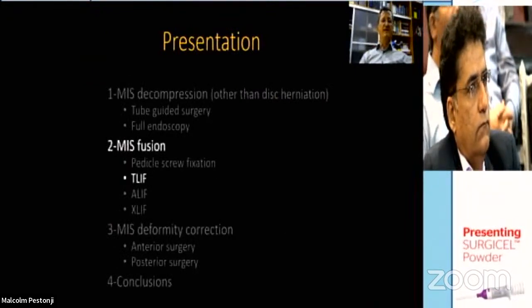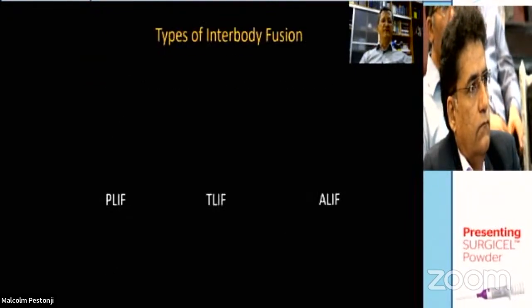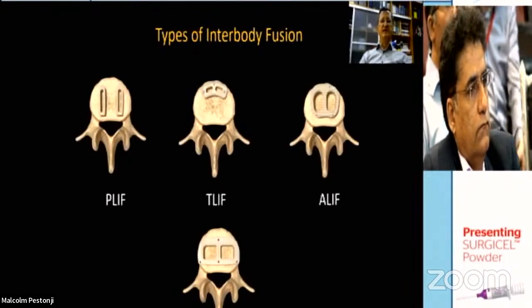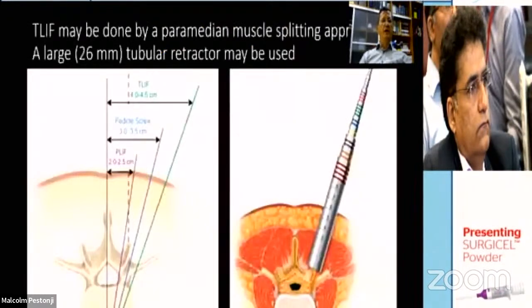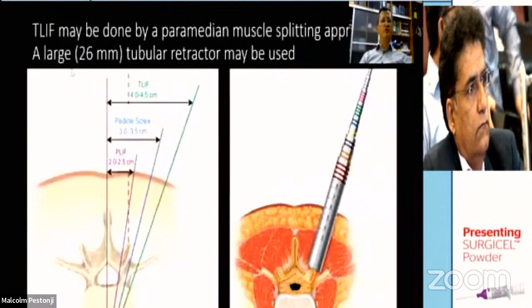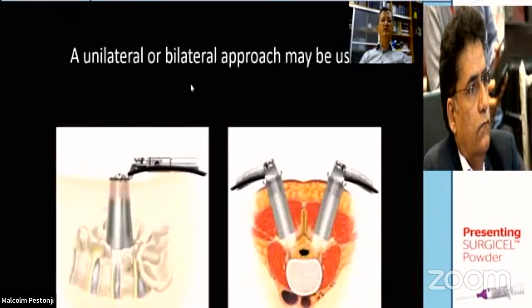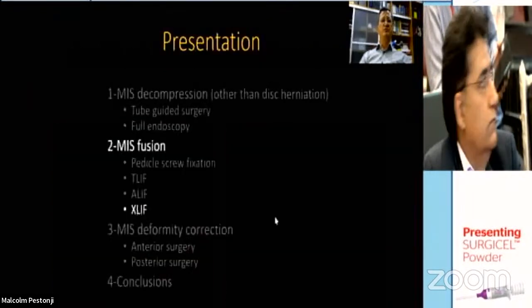What about TLIF, ALIF, and XLIF? Actually, you know all these techniques. These are for interbody fusion. TLIF may be done by a paramedian muscle-splitting approach with a large tubular retractor. A unilateral or bilateral approach may be used.